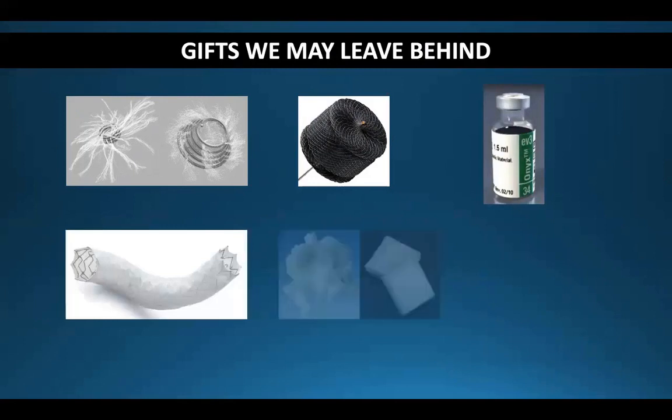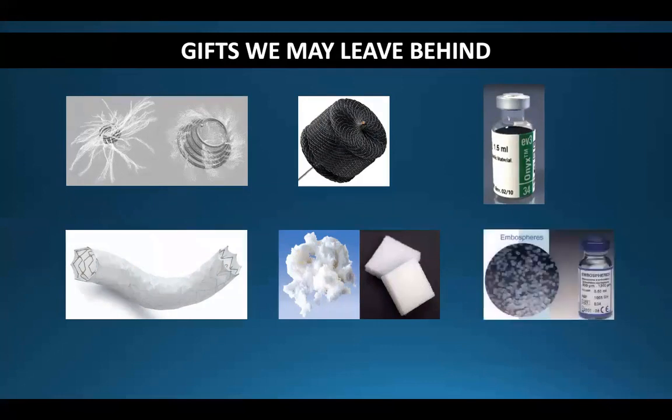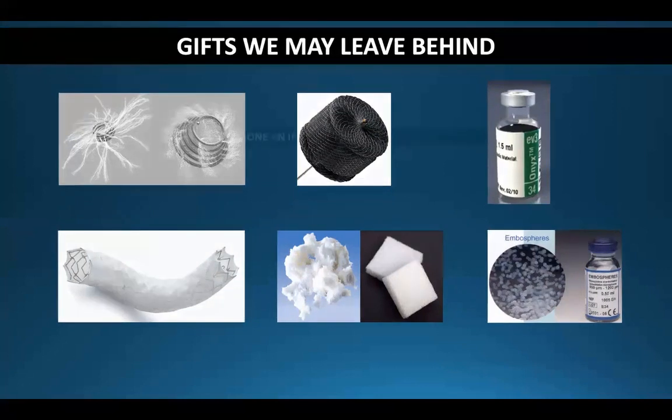That's a covered stent. Avitene on the left and Gelfoam on the right, both of which could be temporary and revascularized potentially. It's not guaranteed. And that is a particle embolic agent. That is pretty much permanent and would not revascularize.